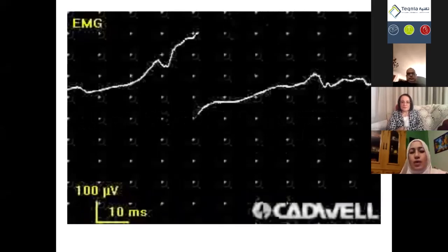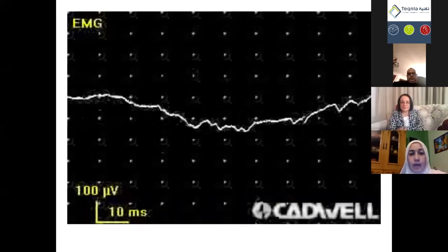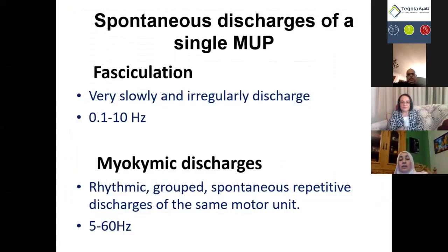This was an example of the complex repetitive discharge. I hope you can hear it. I will let all the videos play again at the end of the lecture.